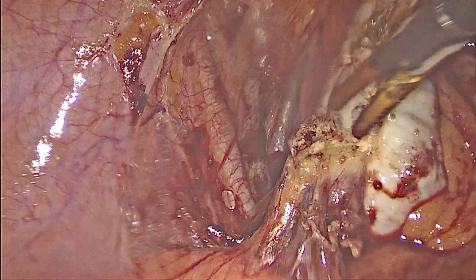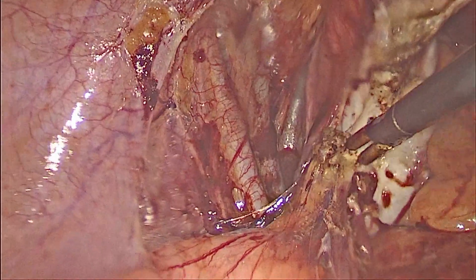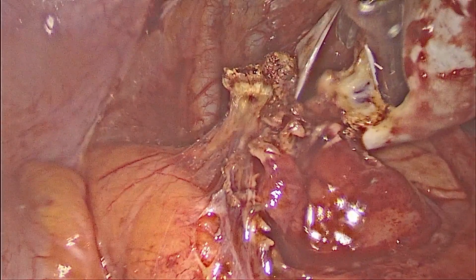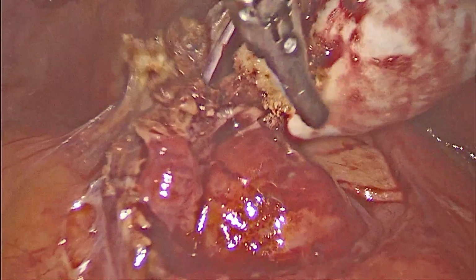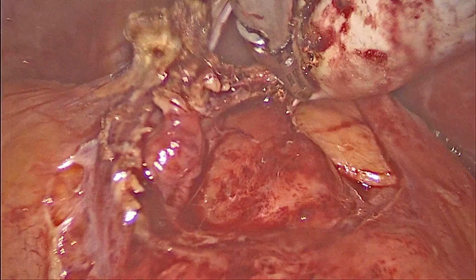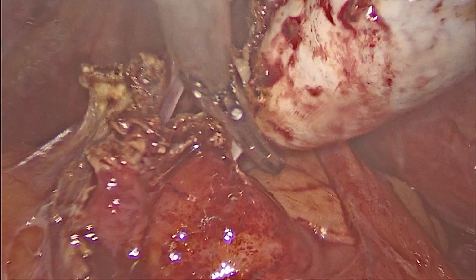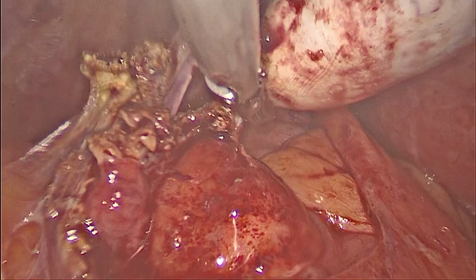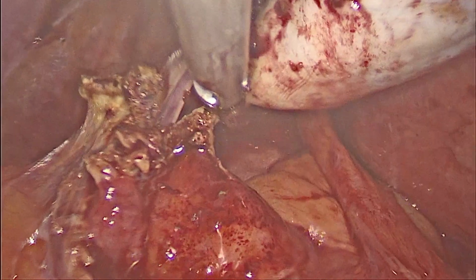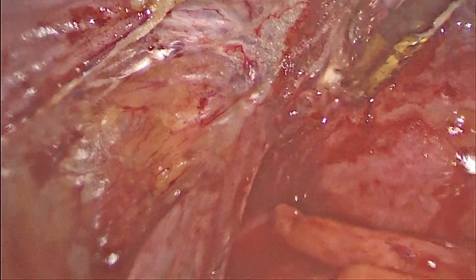Now some part is adhered to the ovary. If we go very close to the intestine, it is better to change over to the harmonic scalpel, which gives better control over the dissection area and a better, clear-cut division. So the major adnexal separation on either side is done.